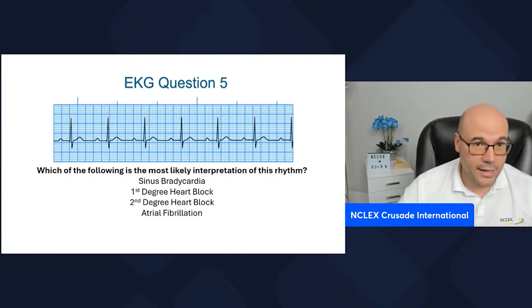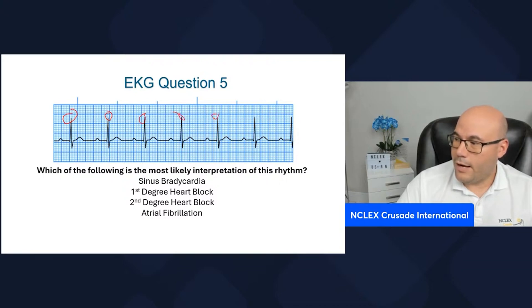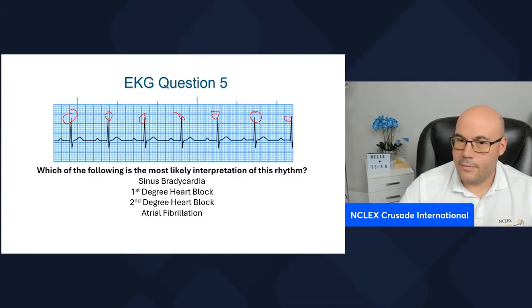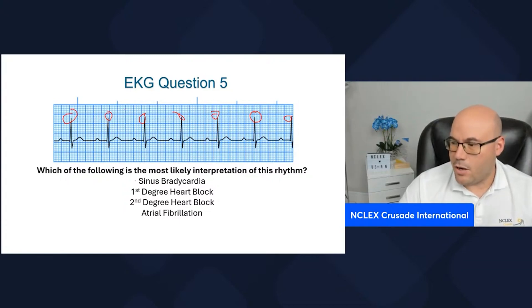Is the heart rate less than 60? One, two, three, four, five, six, seven. The heart rate is close to 70. So this is not sinus bradycardia.